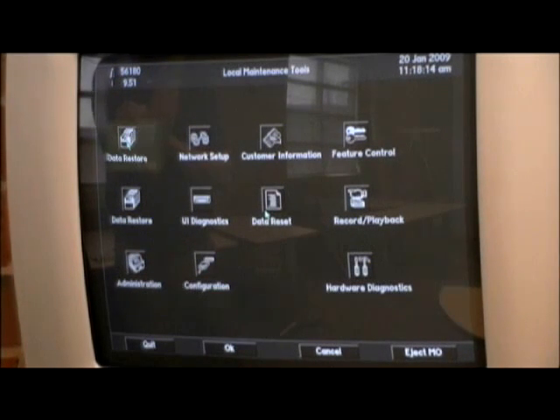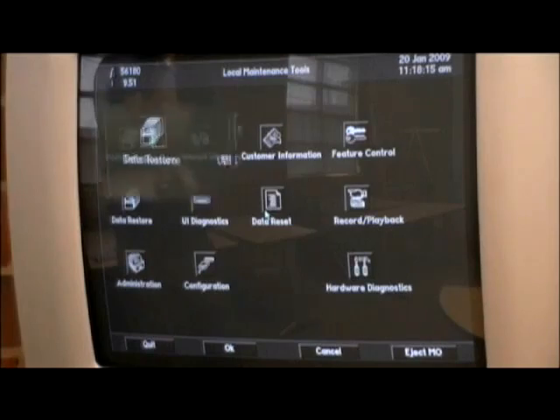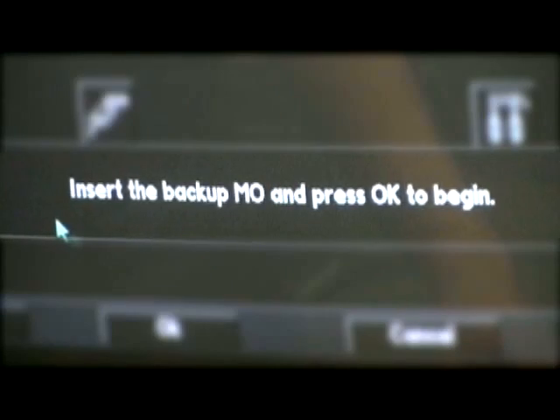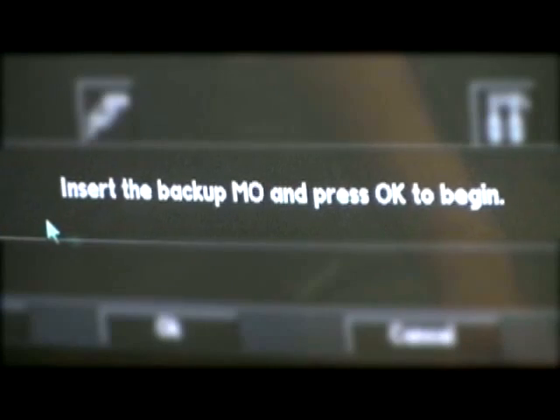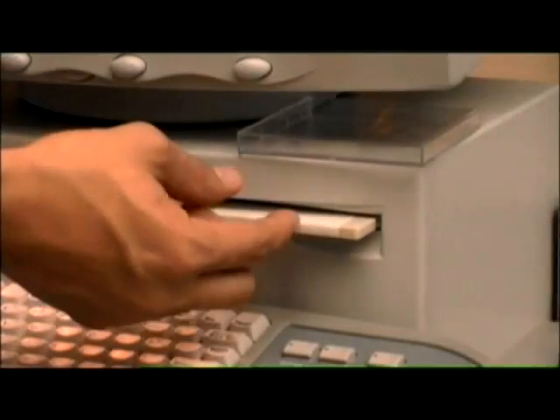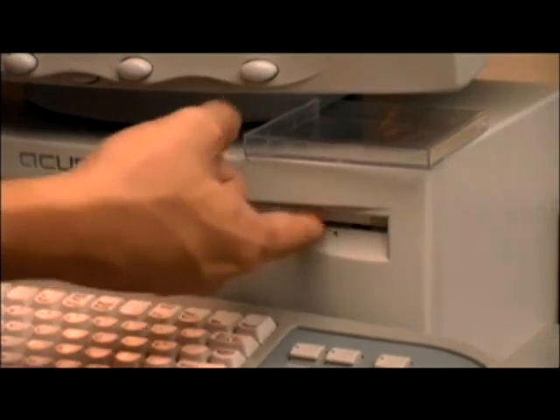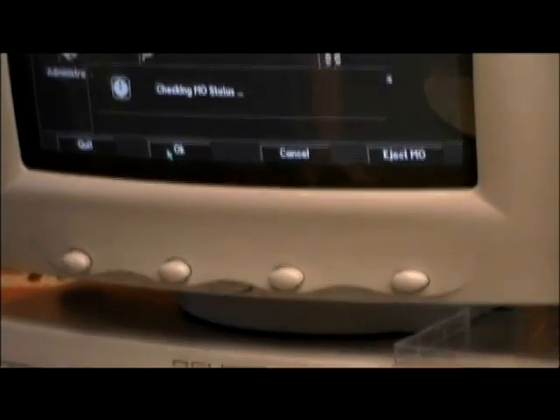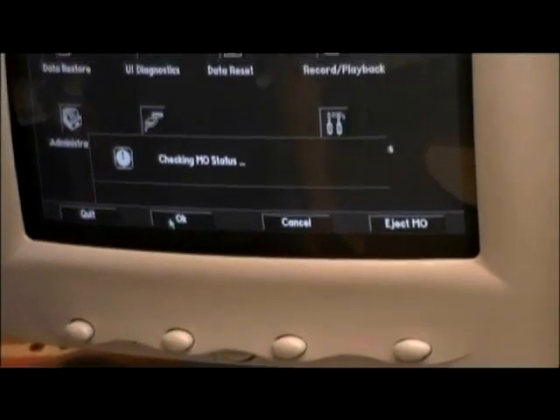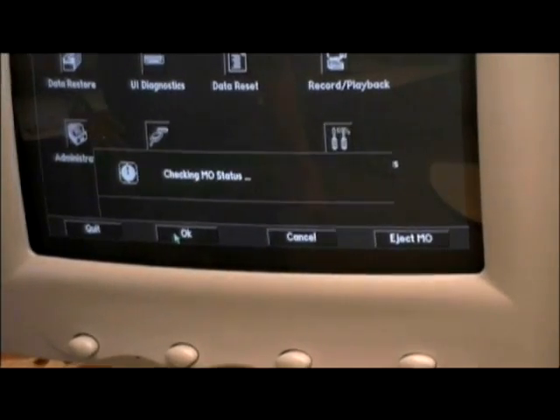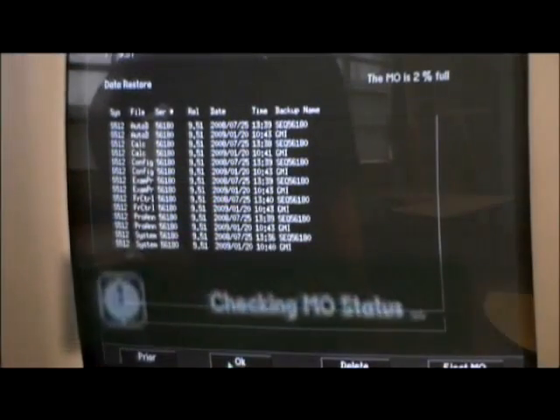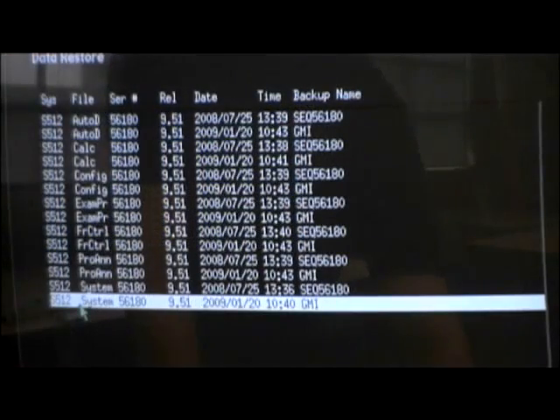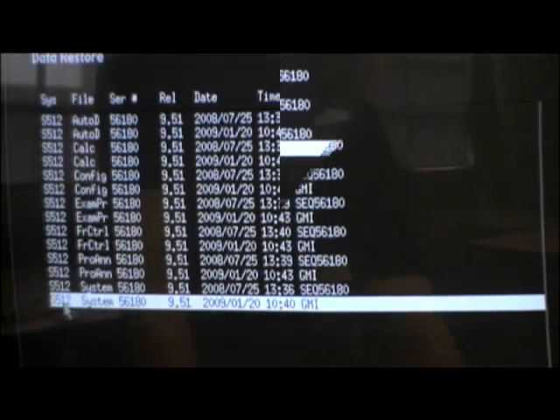Click the data restore icon. You will be prompted to insert the MO disk again. Insert the disk. Click OK. Your system will check the MO status and take you to a screen with the disk's contents on display. Select system data. Click OK.